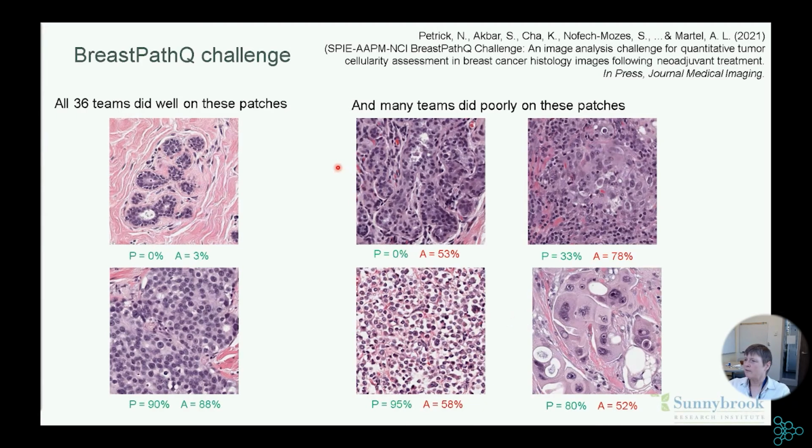So this illustrates that with digital pathology, it's not just the number of tiles that you have for training that's important, but the variability in patients has to encompass the distribution of patches that you want. An area of open research is how we detect when we are out of distribution, and that's a problem we haven't solved yet.